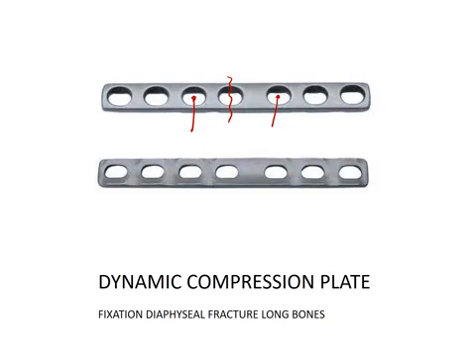But when you put one screw in the center and the other at the edge of the plate, and when you tighten the screw, because this screw has already fixed the bone, when you tighten the screw it requires some displacement of the plate on this side. That's how this fracture side gets compressed, because this plate and the bone on the side where the normal screw has been put will slide together to compress. That's why it's called dynamic compression plating.